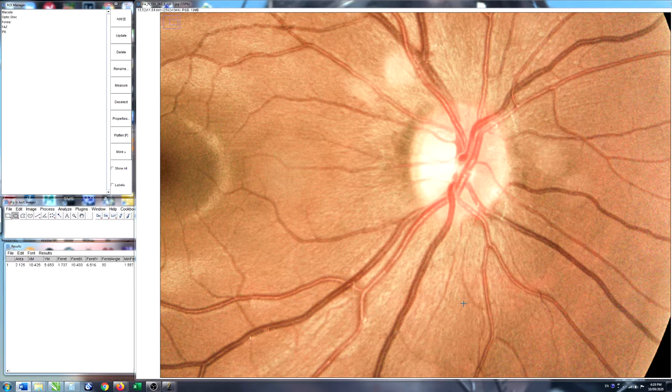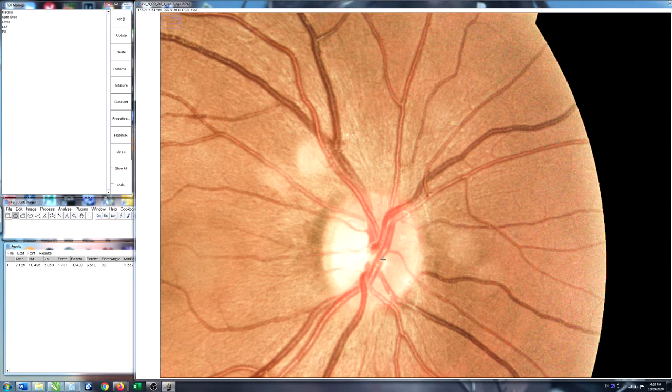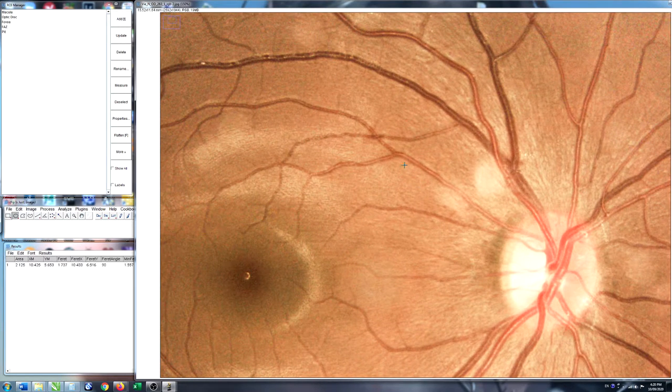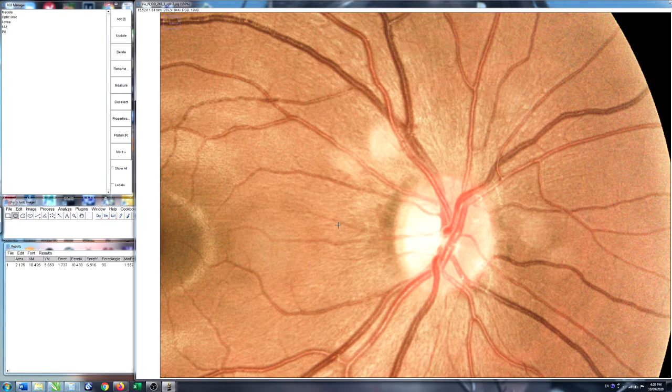As a point of interest, whenever you have blood vessels crossing — what's called an arteriovenous crossing — about 70% of the time you'll have arteries crossing over the top of veins. Occasionally, about 30% of the time, a vein will go over the top of an artery. You can usually see this at the various branch points. Here's an artery going over the top of a vein, and so on — something to keep an eye out for.